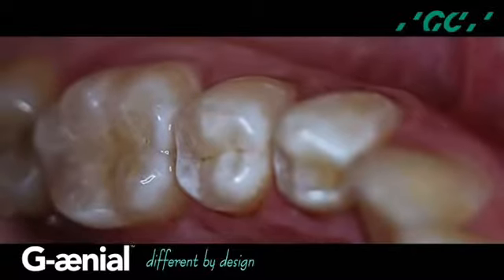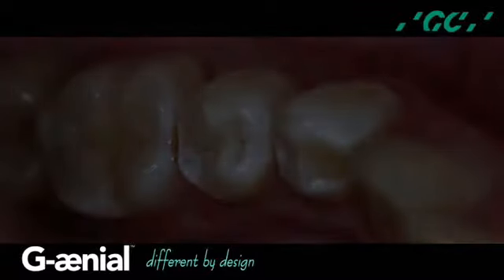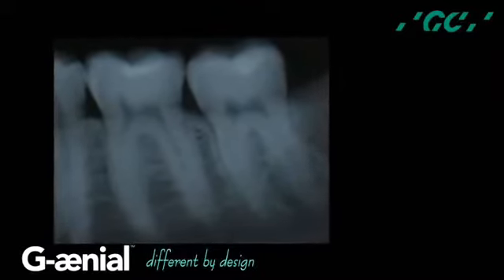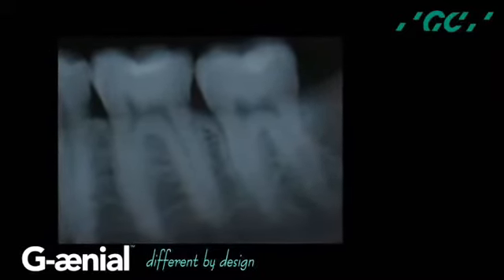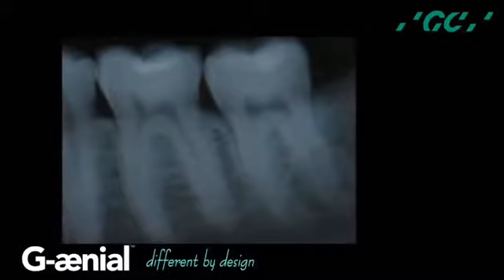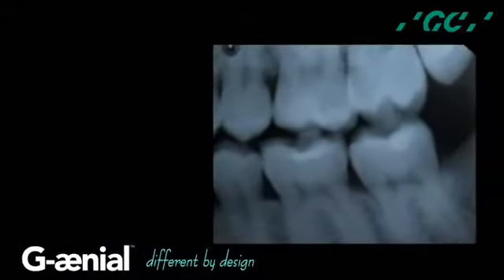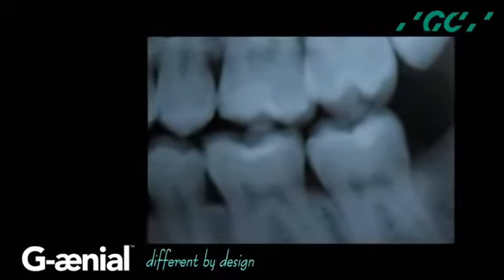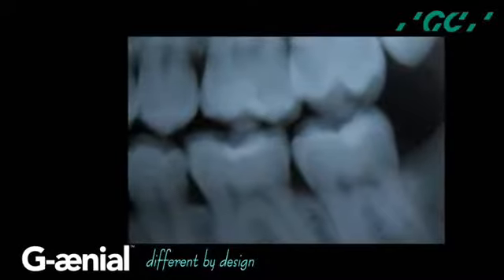A prerequisite of all biomaterials is adequate radiopacity to allow the clinician to evaluate and distinguish caries from the restorative material at recare visits, and also to detect voids, overhangs, and open margins. As you can see at this 3-month recare visit, G-aenial universal flow has this requisite with radiopacity equal to enamel.